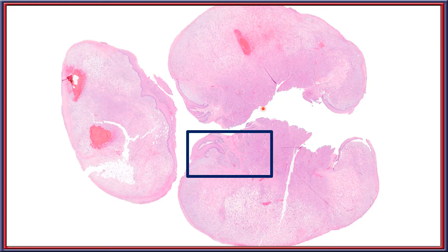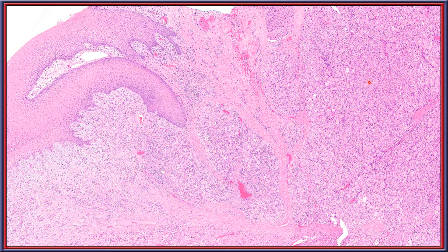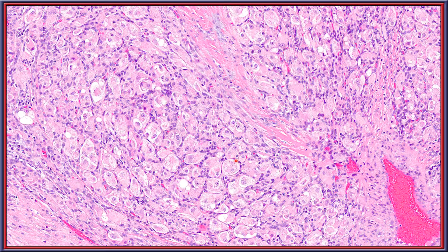On higher power, you can see the surface epithelium coming into the tumor, where the neoplastic proliferation is confined to this space in a very well-developed alveolar architectural appearance. The cells are very large polygonal cells with prominent small nucleoli present within the cytoplasm.